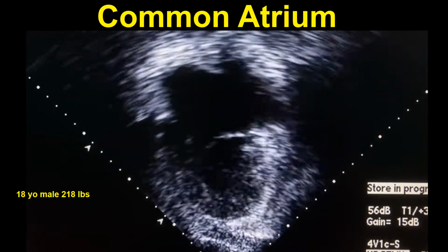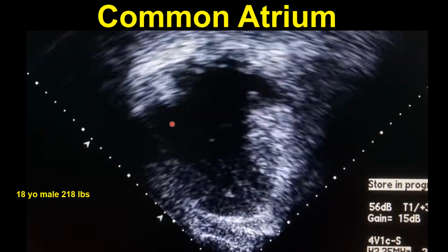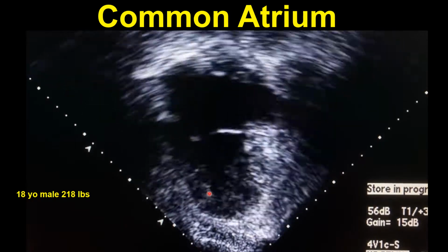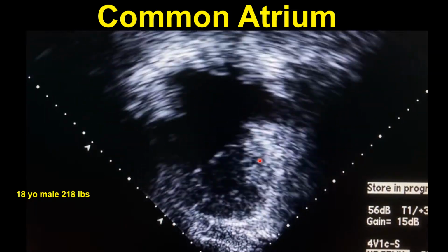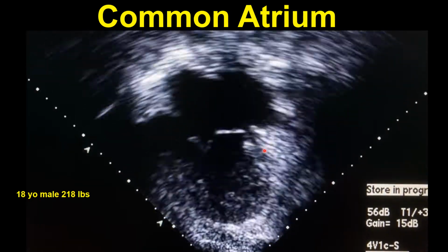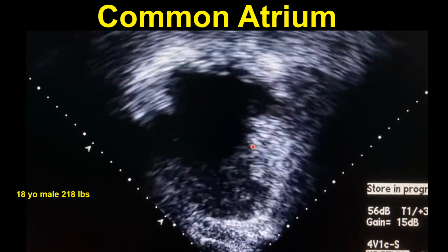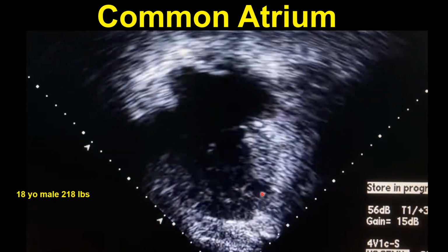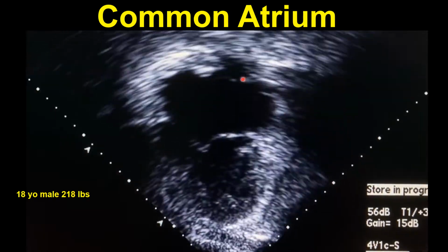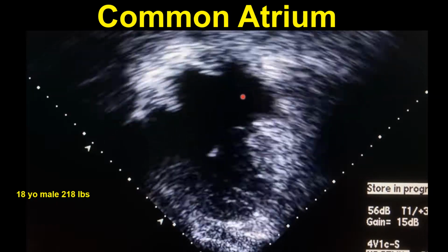We can see the common atrium and the type C atrioventricular valve. Notice that there are no chordal attachments. This is probably an anatomic right ventricle. These patients typically have common valve, double outlet right ventricle, and pulmonary atresia. But we can also see some unusual movement, a little bit of fluttering.